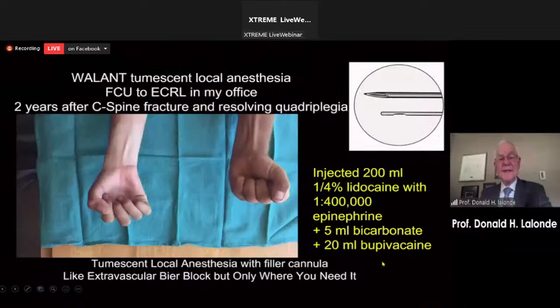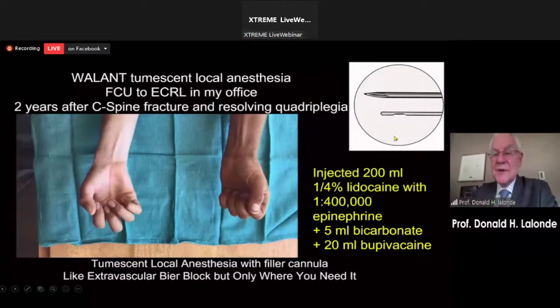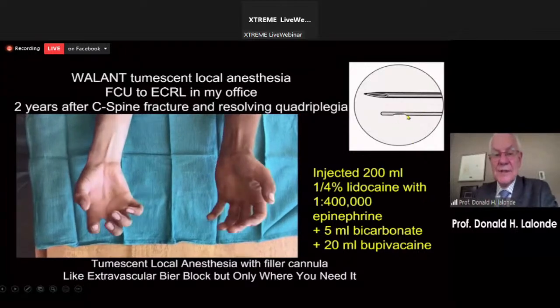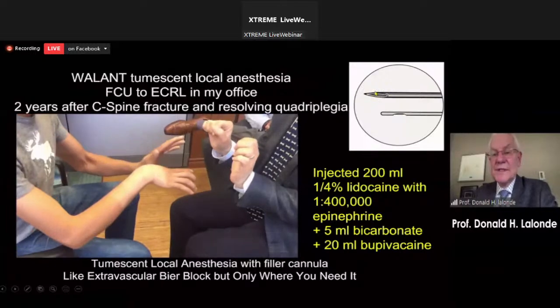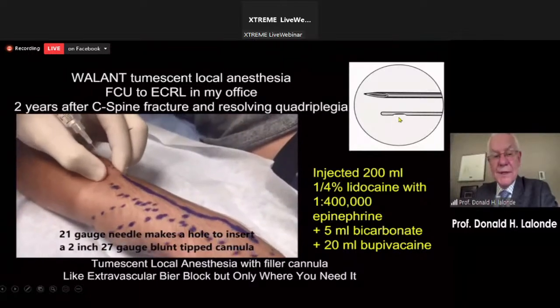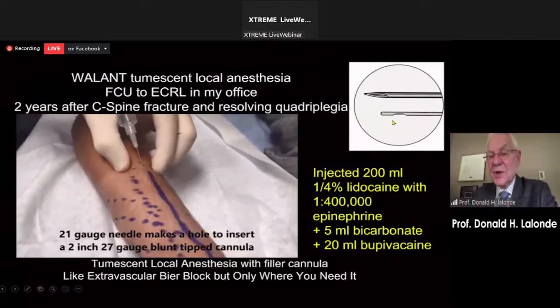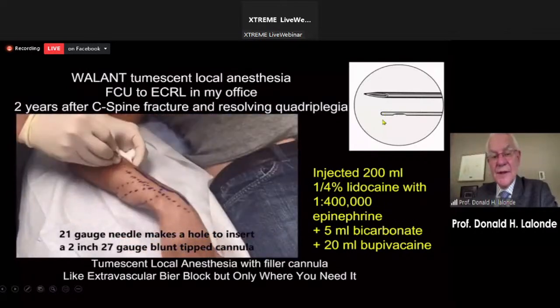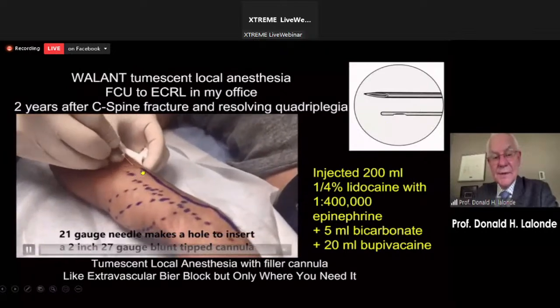This is a tendon transfer. And in this case, we're going to use a filler cannula to inject the local anesthesia. So you make a hole in the skin with a bigger needle, and then you insert a blunt needle tip. This is what plastic surgeons and dermatologists use to inject hyaluronic acid. So there's the blunt tip.